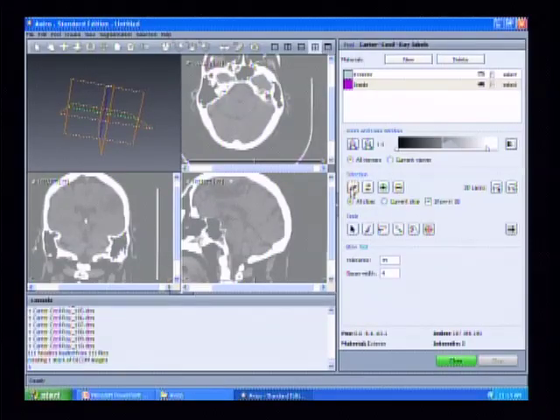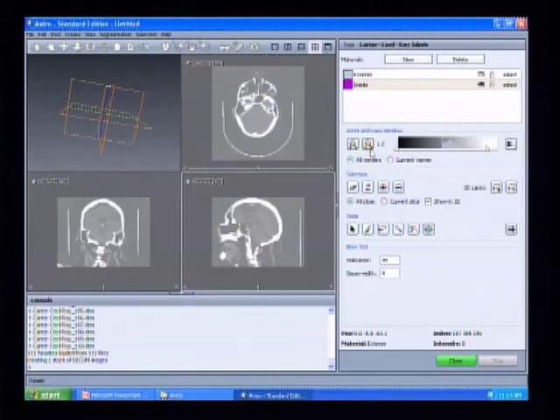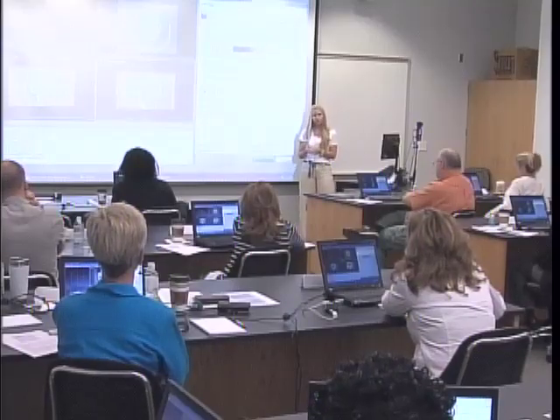So these are all the three main tools that are described at the bottom of page 5 of your instruction sheet. What I mentioned at the start is we've already gone through and done some image processing steps so that the data set looks the way that it does. We did this in order to create a high resolution scan, but this also made our segmentation process very uniform.